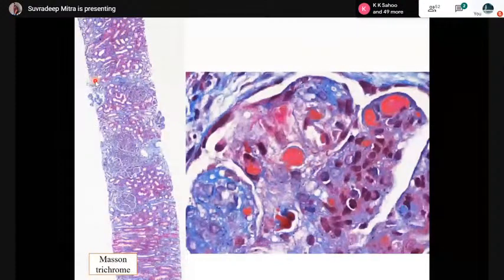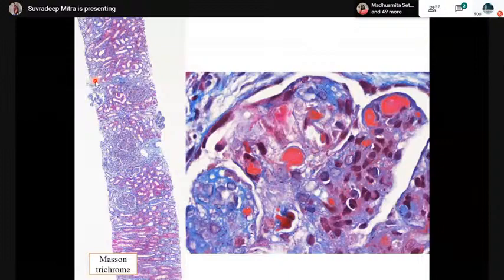IFTA, in any disease pathology, even though it's a glomerular pathology, usually correlates very well with the clinical feature and the disease progression. So if you see more than 50% IFTA in a particular renal core, you alert the clinician that probably the disease is already quite advanced and probably the drug is not going to help very much. However, if you find the IFTA is 20% or 15%, 30%, you can still tell the clinician that yes, you can have a nice trial with immunosuppressive agents and corticosteroids.